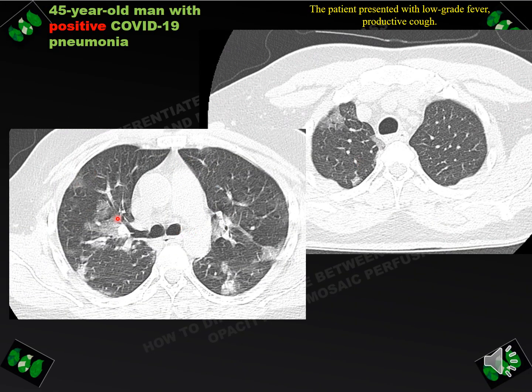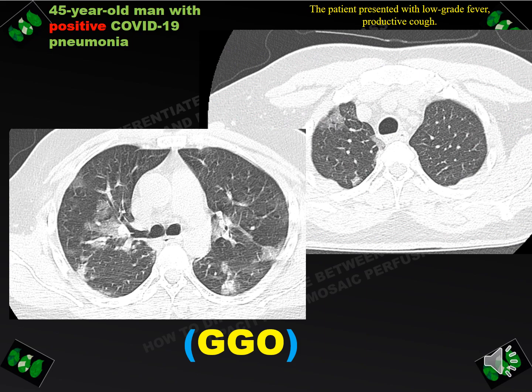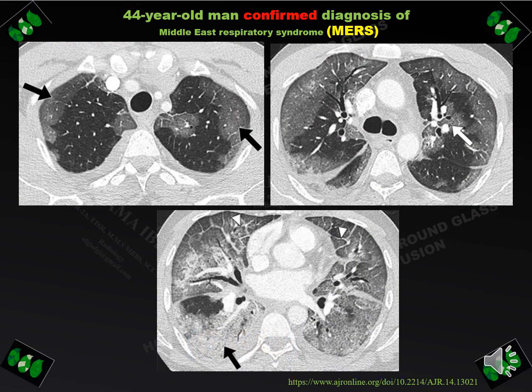Another case shows alternating areas of abnormality within the lung parenchyma — areas of high attenuation and areas of low attenuation. If we look at the blood vessels, we can see the blood vessels in the low attenuation area are preserved. So the abnormality is ground glass opacity in the high attenuation area, in this patient positive for COVID-19. The diagnosis here is ground glass opacity, not mosaic perfusion. Another example confirms normal blood vessel size and amount in the low attenuation area, so the high attenuation area is diagnosed as ground glass opacity.